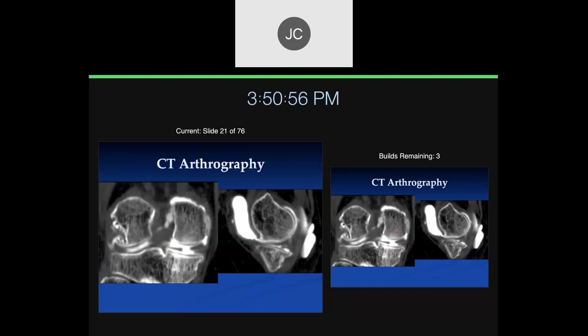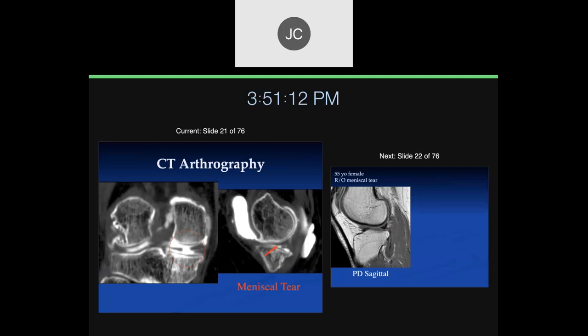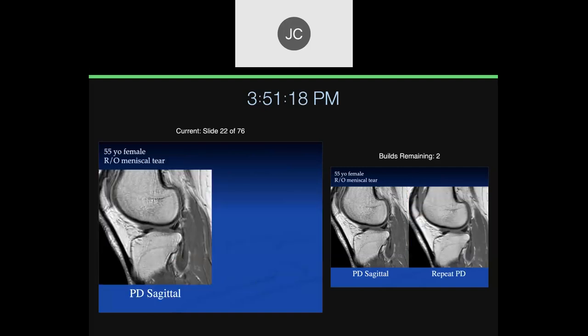You can also do CT arthrography of the knee. If someone can't do an MR scan, we very rarely do this, but you can see a meniscal tear on CT arthrography as well using the standard criteria.